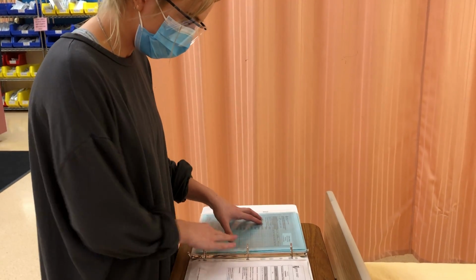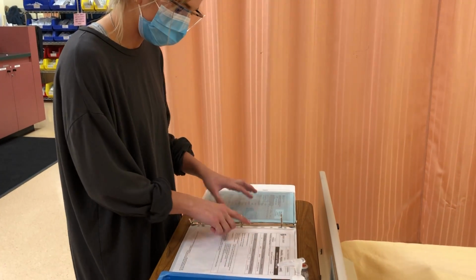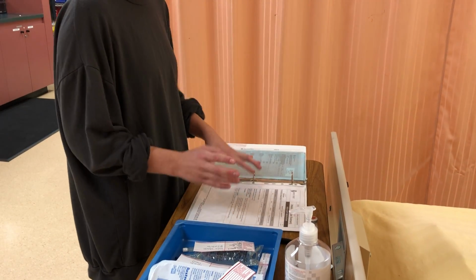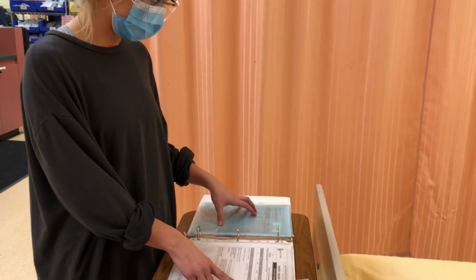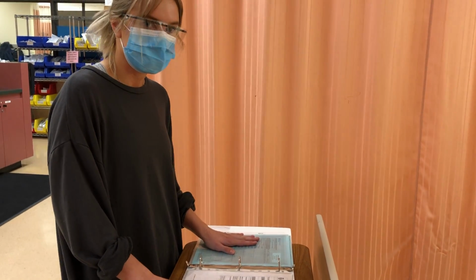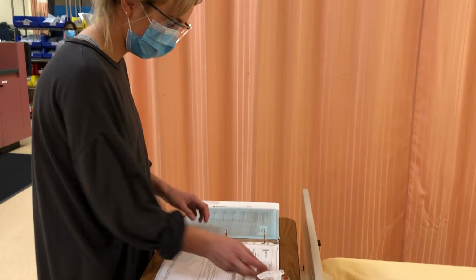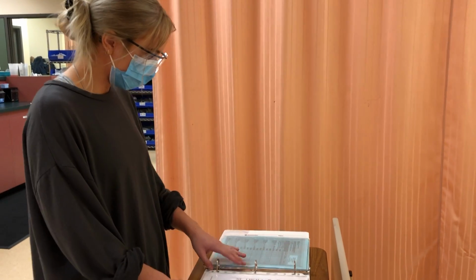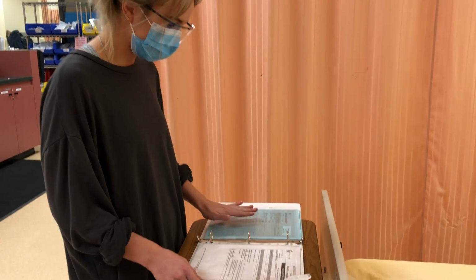Our dose, so when we draw it up, we will be drawing 1 ml out of this medication, which will be 100 units. We'll be putting that 100 units into our bag. That will be our total dose. We'll have a final concentration of 0.99 units per ml. So we're going to be running that over 2 units per hour. Our route, it's been ordered as a continuous IV. We've gone over the PDM for continuous IV, and we're going to be drawing up a continuous IV med. It's been ordered for today and now, and we are going to draw it up today and now. So we've done our 5 checks.